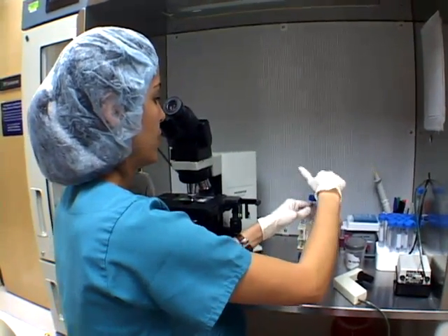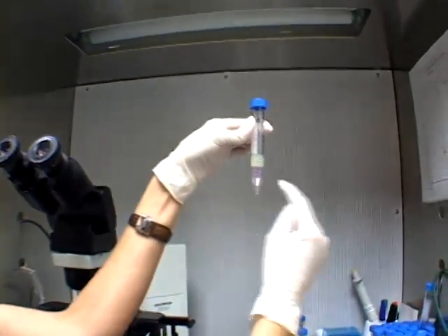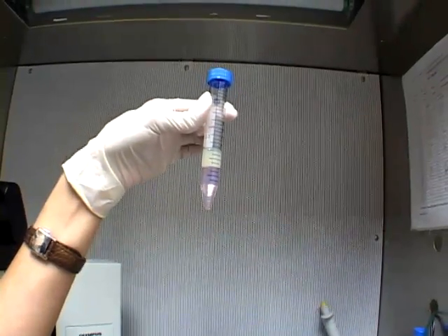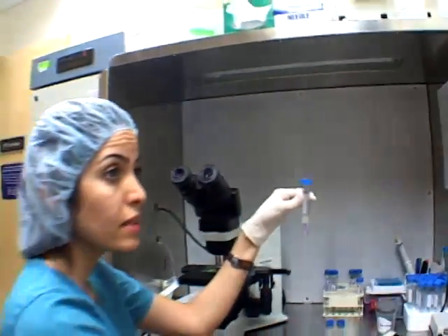Before I start, we have 80% liquid here, we have 40% on top, and we have sperm on top of that. Now we put it in the centrifuge for 20 minutes.